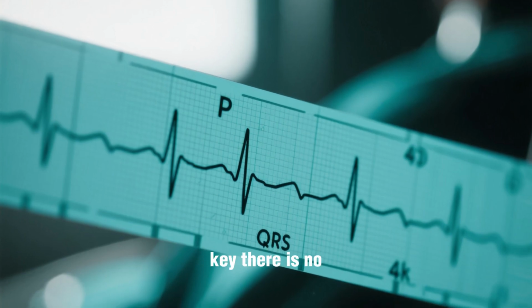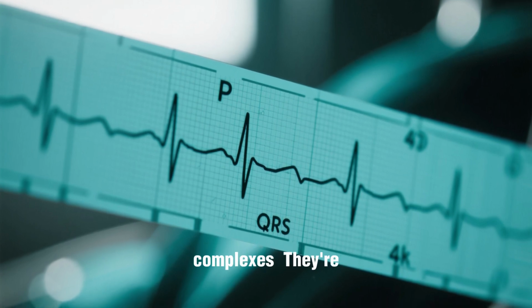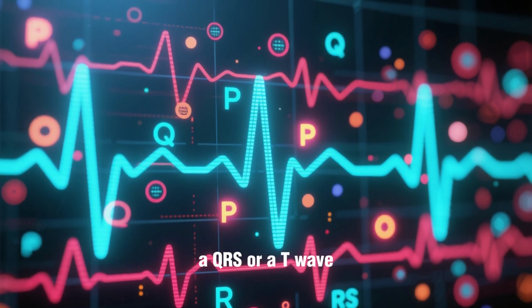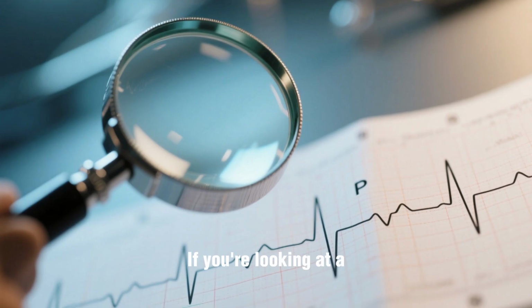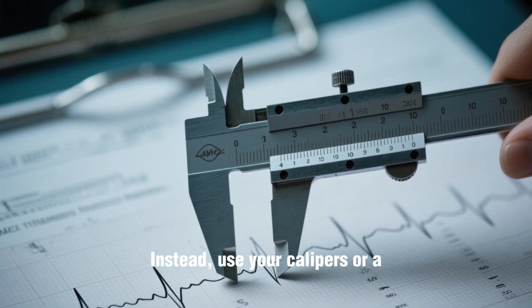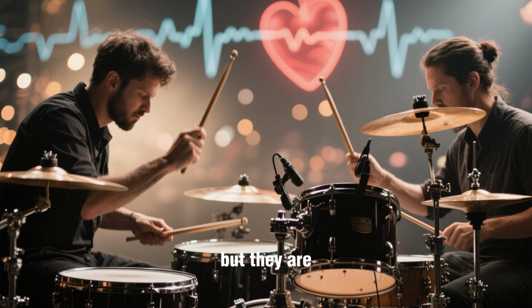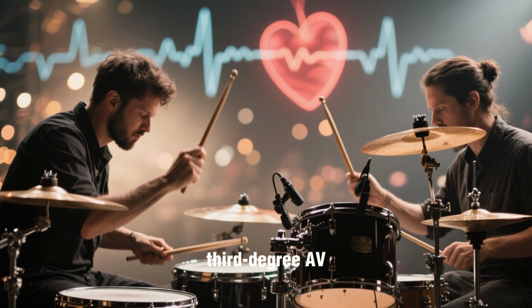And this is the key: there is no logical relationship between the P waves and the QRS complexes. They're just doing their own thing. P waves might appear right before a QRS, right after it, or they might even get buried inside a QRS or a T wave, which can make the rhythm look really chaotic at first glance. If you're looking at a strip and struggling to find the P waves, don't panic. Instead, use your calipers or a piece of paper and march out the intervals. If the atrial rhythm is regular and the ventricular rhythm is regular, they are clearly marching to the beat of their own separate drummers. You are looking at a third-degree AV block.